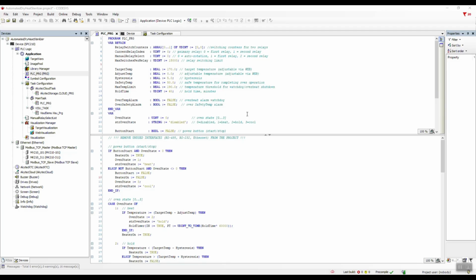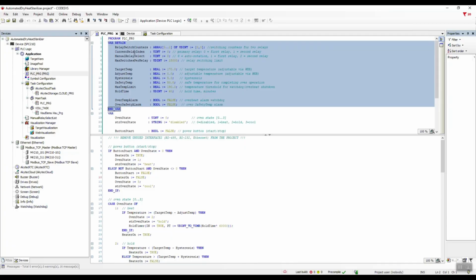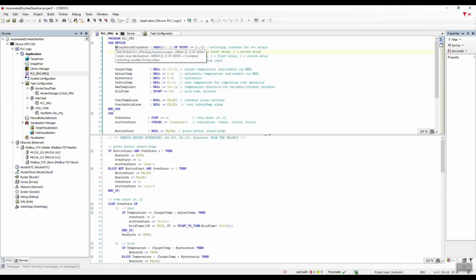Now, let's declare the variables corresponding to the sterilizer settings. Some of them need to be retained even if the controller is powered off. To store them in non-volatile memory, we use the VAR retain area. I'll briefly comment on the purpose of each variable.